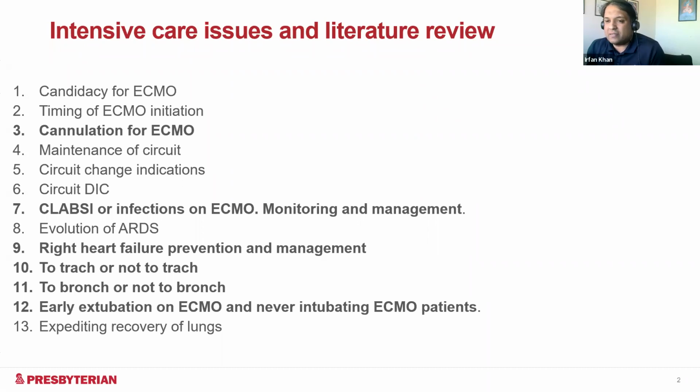So the other questions are how to manage these patients on the ventilator, evaluating for VAP, evaluating for atelectasis or any kind of situation, whether you would bronch them or not. If you bronch them, the risk of infection goes high because of the aerosol spread. When we first started off offering this therapy to this patient population, the biggest fear people had was that if we bronch them, we are going to get infected. At that time, there were no vaccines, and everybody among healthcare providers was very afraid of offering this therapy. So we've had a few patients who we think in retrospect could have benefited from it.